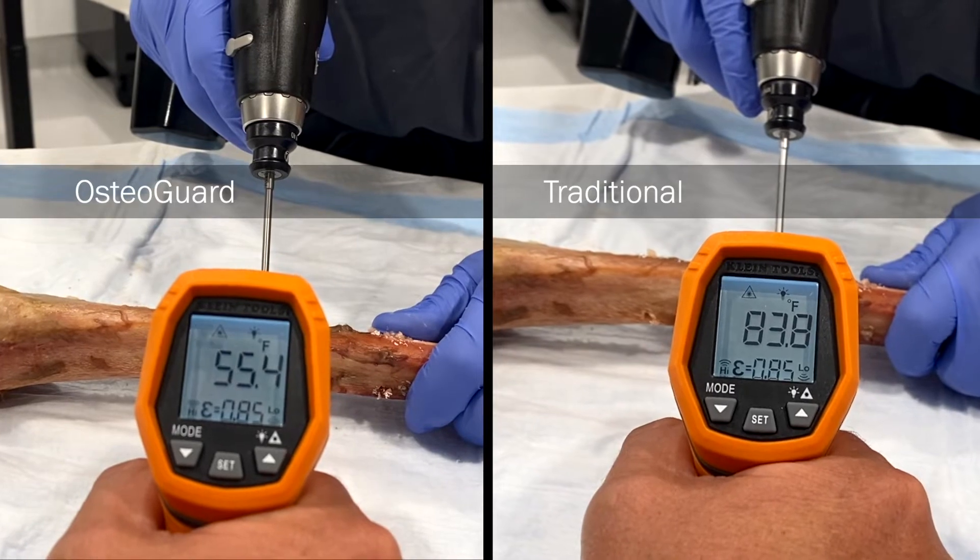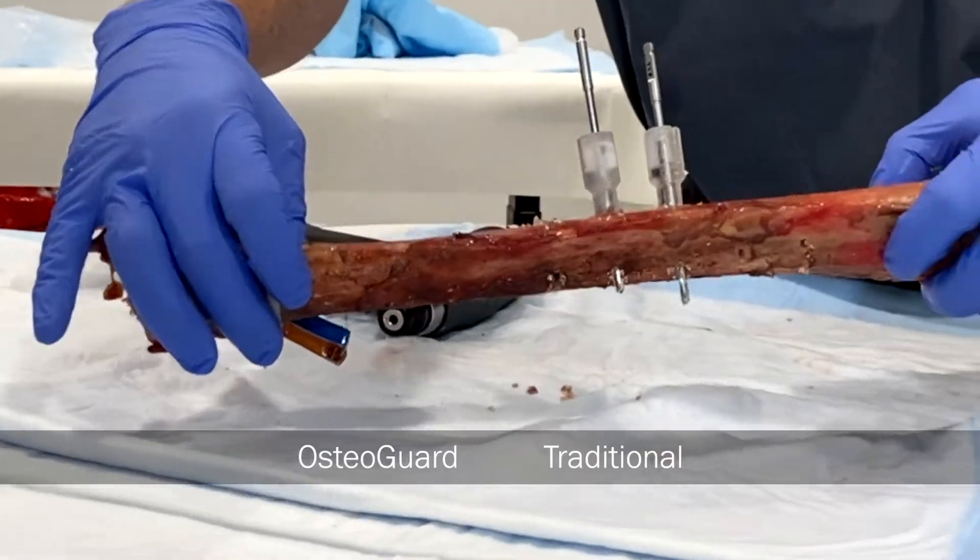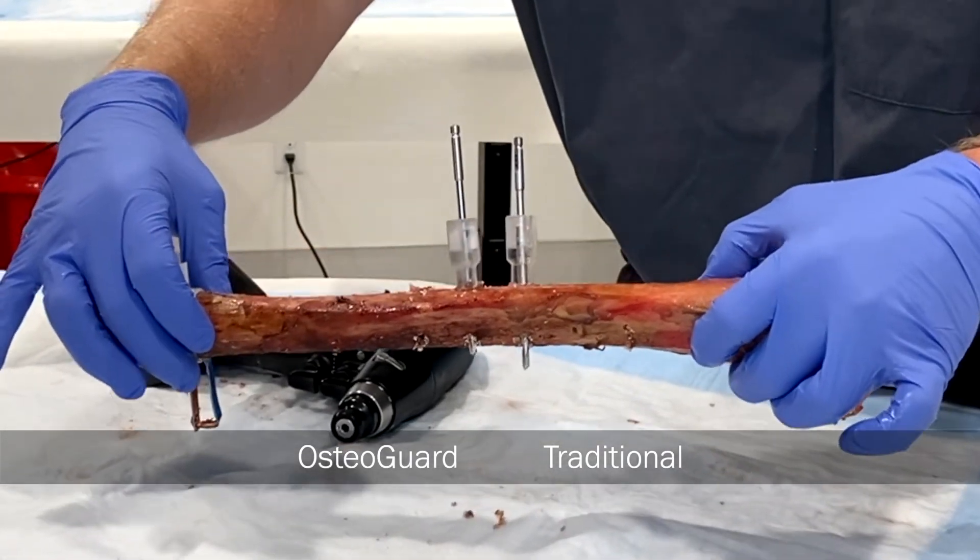I also notice that I'm able to detect when I'm going through each cortex, so there's less plunge in the far cortex, less soft tissue disruption.